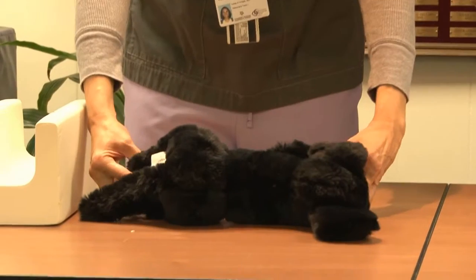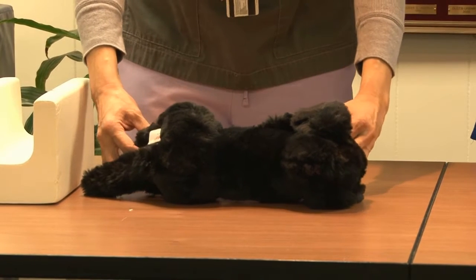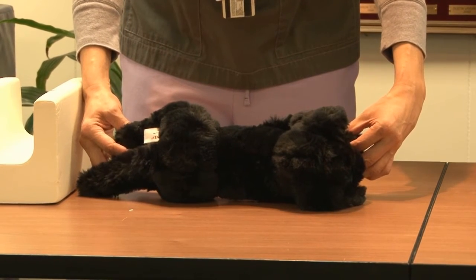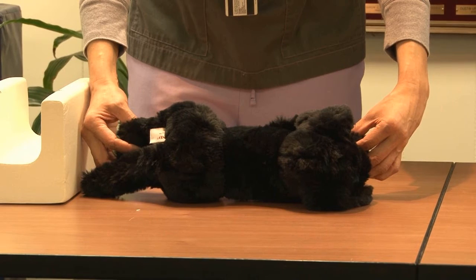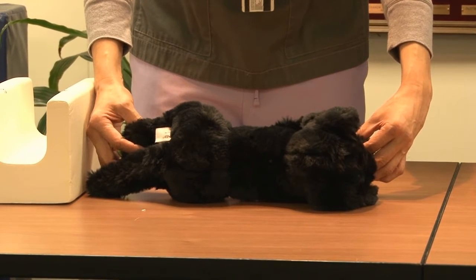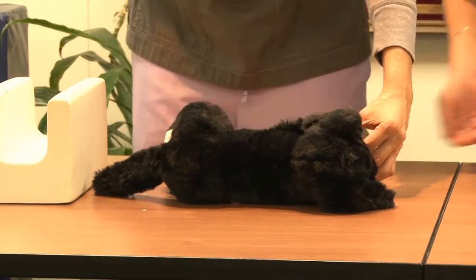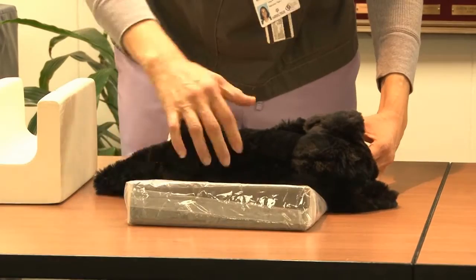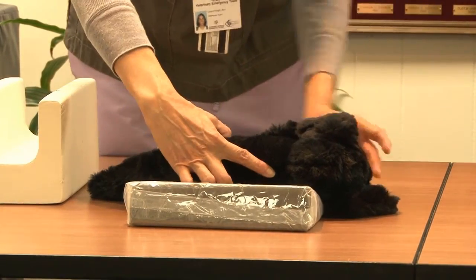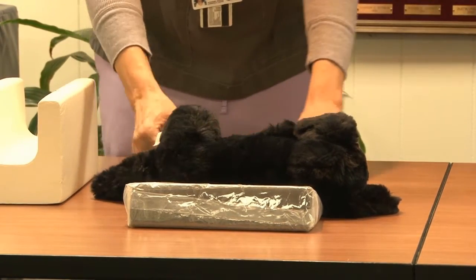Lateral thorax: the dog is in right lateral recumbency. For the thorax, you want to ensure the animal's head is up out of the way. You want to stretch the forelimbs cranially towards the head, and then extend the back legs caudally out away from the abdomen. Make sure the animal is not rotated — if you need a wedge to put underneath the abdomen or sternum, you can do that. Place your hands on the back of the spine and one hand on the sternum, and you want your hands to be parallel with the table.